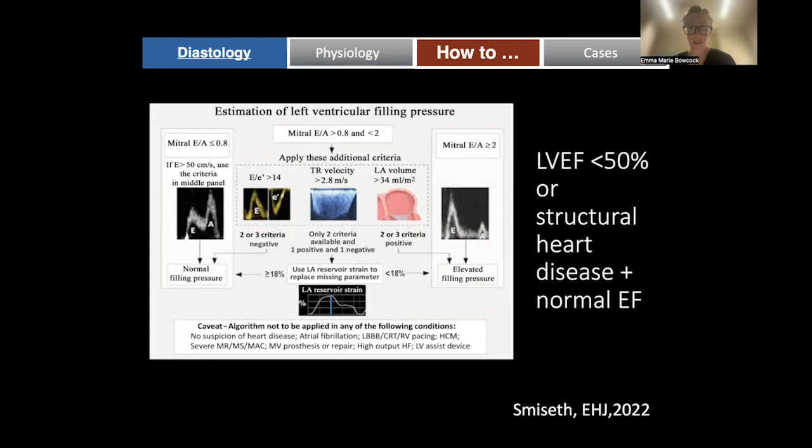Then yeah, that's all really. So just a couple of cases to, I hope, emphasize to think about the guidelines and just have your framework really clear for that. This should be brainstem level. So everything on this sort of page here should be brainstem. The next step is then thinking about the other things that they're showing you, the clinical correlation, what that means to you in terms of your management, and then knowing those little caveats of, but this patient has severe MR, so I can't use that one. So therefore I'm going to look for this and this. Or this patient has significant mitral annular calcification, so my E primes are going to be down. I think that just gives you like that little cherry on top as well during the vivas, knowing those caveats.